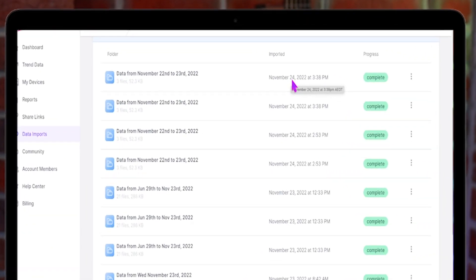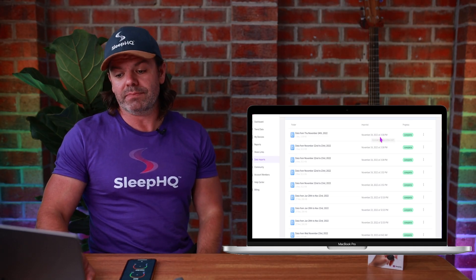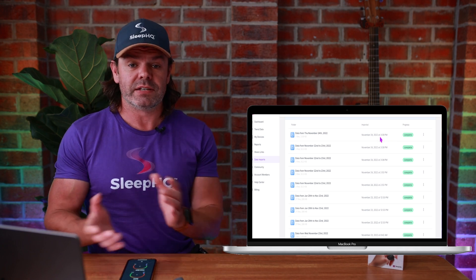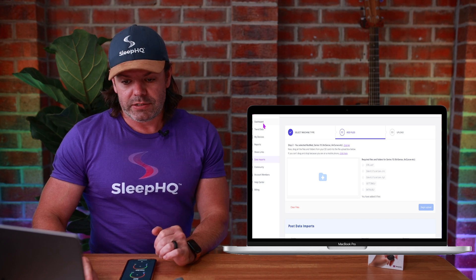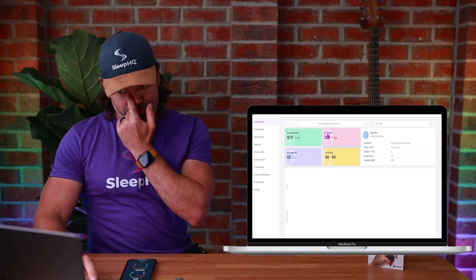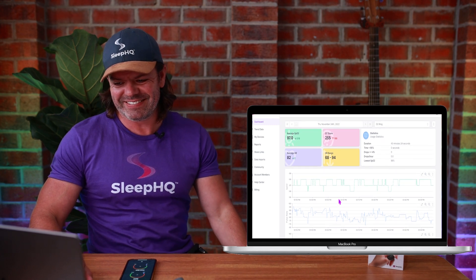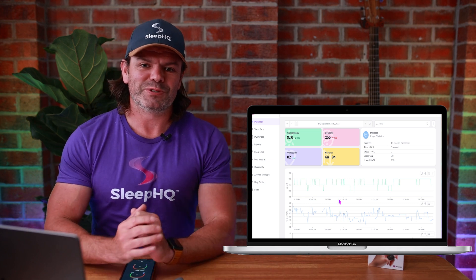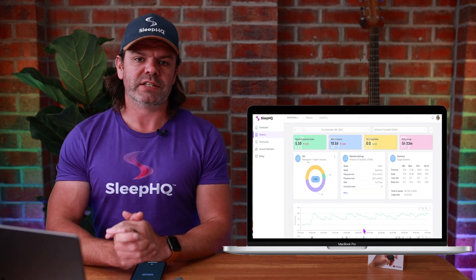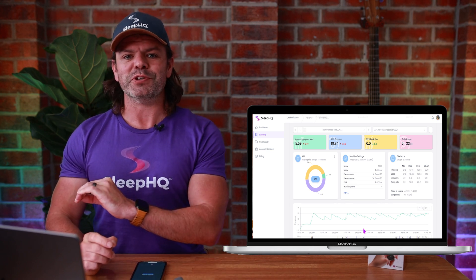Let's have a look — there it is. November 24th, 3:39 PM. The data has synced with my Sleep HQ account. Coming up here to the dashboard — there it is, the information right there ready to go. Really cool stuff. And here's how the O2 ring data looks combined with CPAP therapy data on the Sleep HQ dashboard.